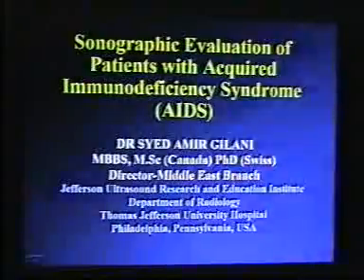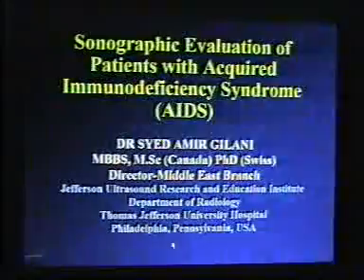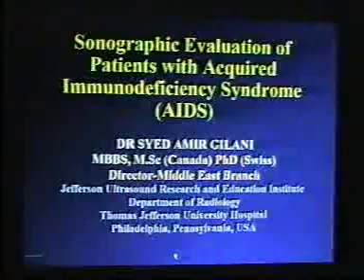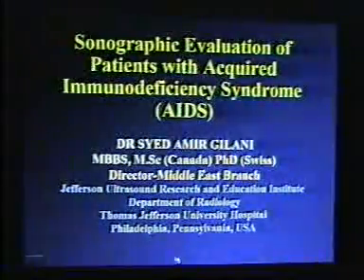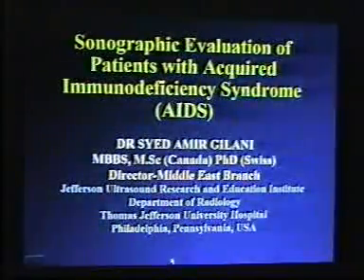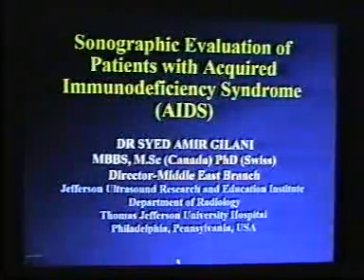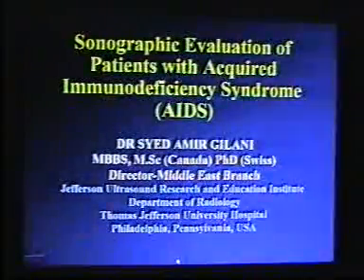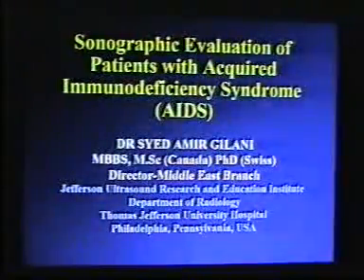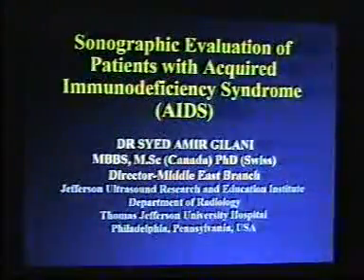I am very thankful to all of you for participation in this seminar here in Dubai, and here is my lecture which I presented in Switzerland, and this was the topic on which I got my PhD from Switzerland. This is sonographic evaluation of patients with acquired immunodeficiency syndrome, which is called AIDS, and I am Dr. Gilani, Director of Middle East Branch of Jefferson Ultrasound Research Education Institute from Department of Radiology, Thomas Jefferson University Hospital, Philadelphia, Pennsylvania, USA.